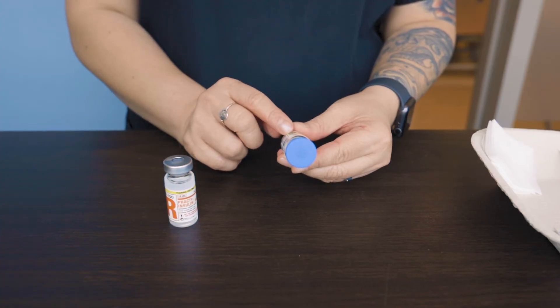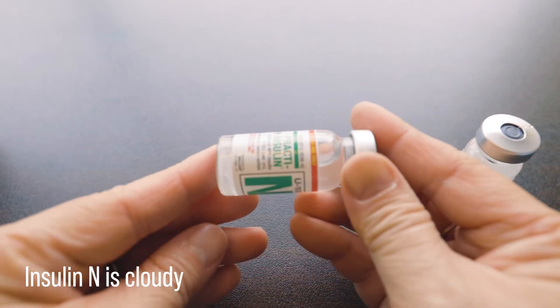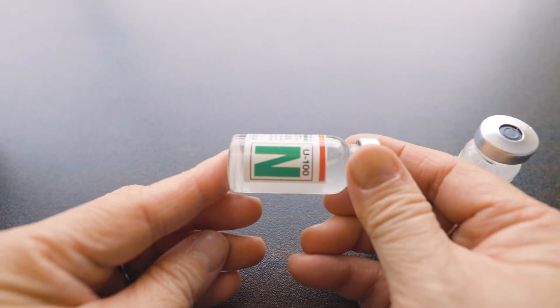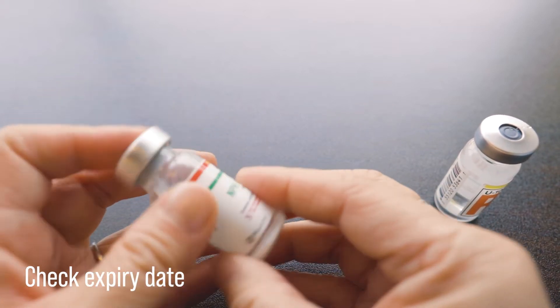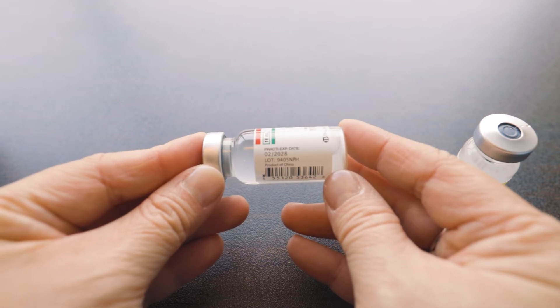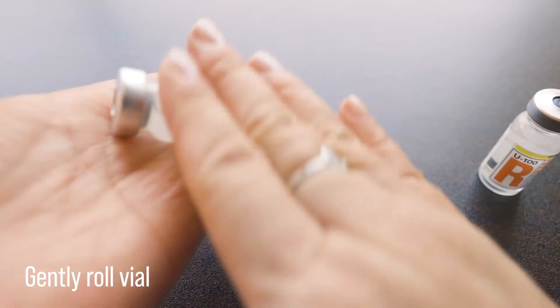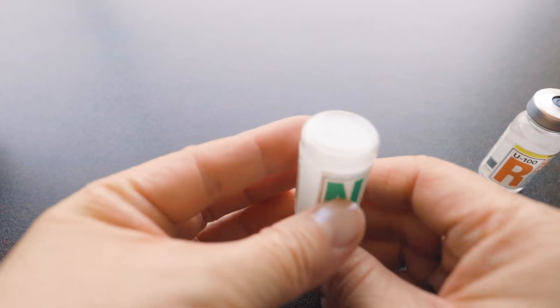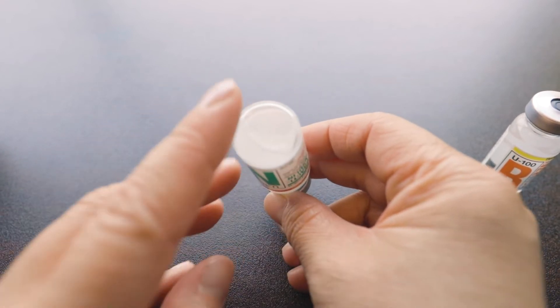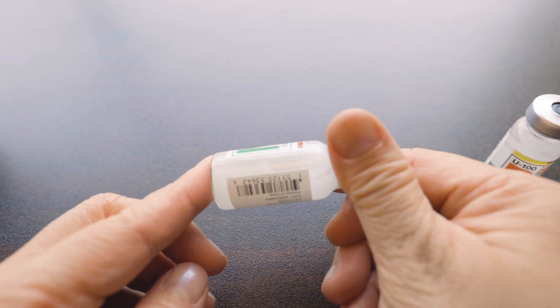Our second vial reads Practice Humulin N. We can see that it is cloudy, which is normal for this type of insulin. We're checking the expiry date — for this one, it's February 2028. Keep in mind that insulin is good for about 28 days from the time that it was first opened. We want to make sure to roll the vial gently to mix it properly and check that there are no remaining sediments on the bottom of the vial. Try to avoid shaking the vial, as this will form more bubbles in it.